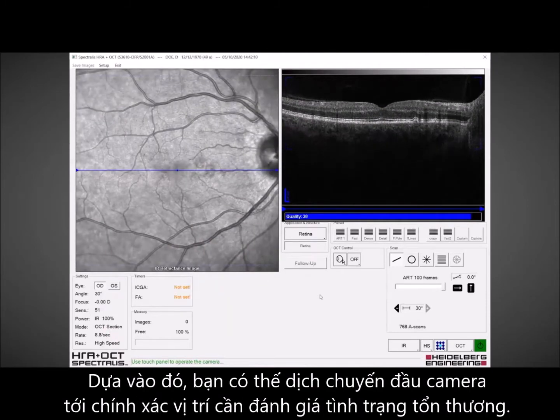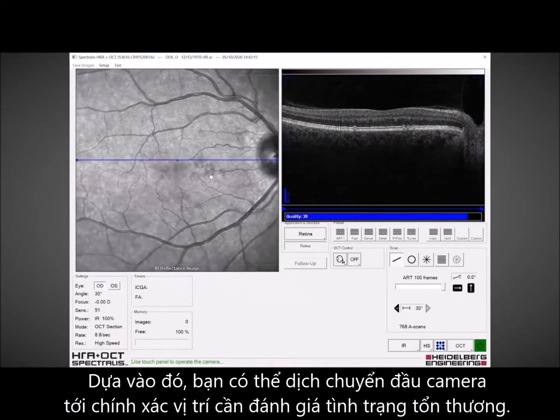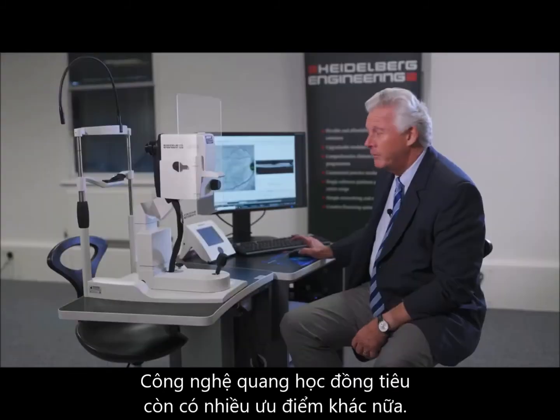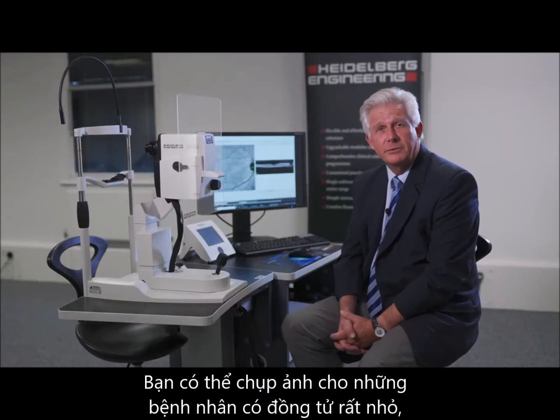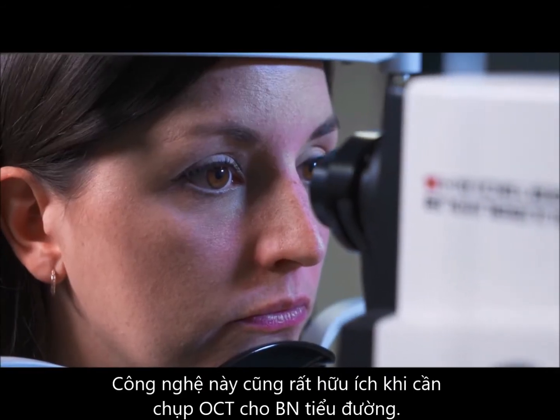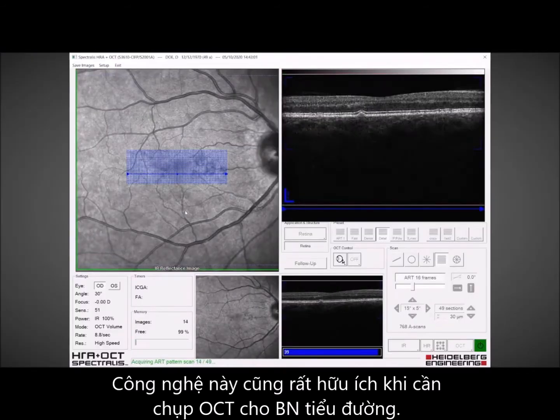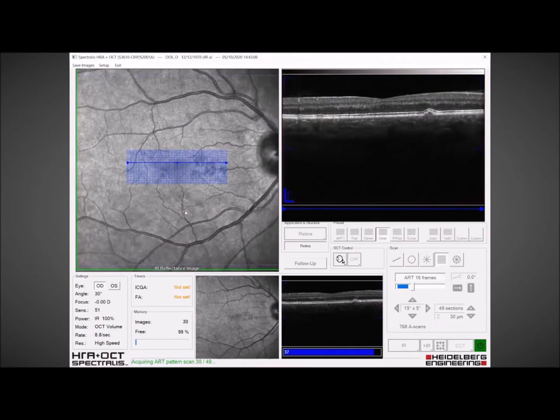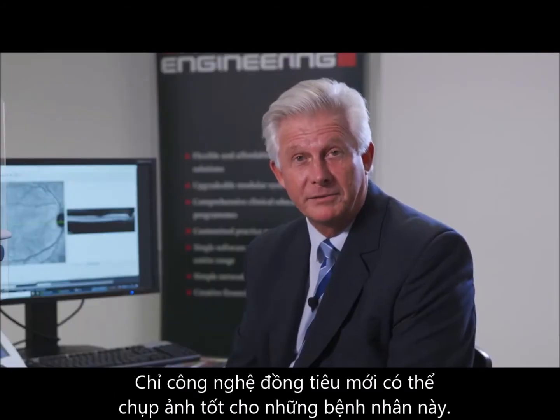And you can move your OCT exactly to the location that you need to in order to document the condition of the fundus. Confocal optics has other advantages. You can actually get into very small pupils, and so this is very useful for diabetic patients, because diabetic patients don't dilate very well and they're hard to image. So there's an advantage just in confocal optics to examine diabetic patients.